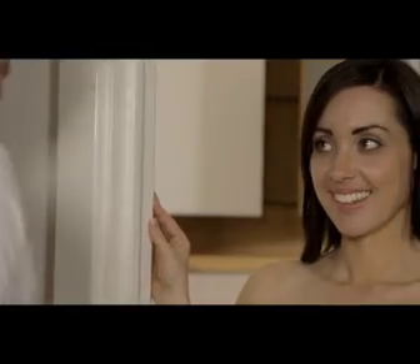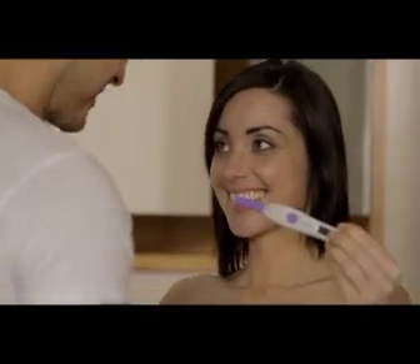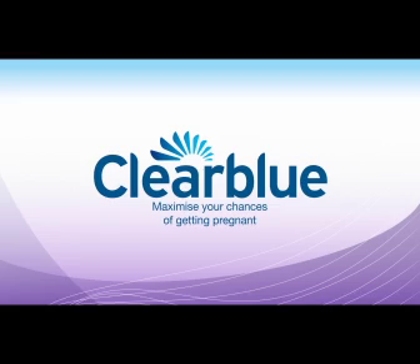Clearblue Digital Ovulation Test with Dual Hormone Indicator. The only test that typically identifies your four most fertile days, so you have more opportunities to conceive. Clearblue — maximize your chances of getting pregnant.